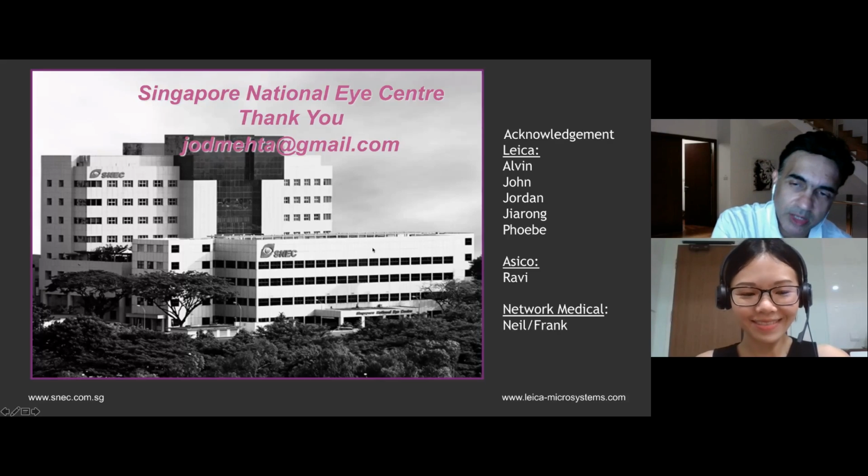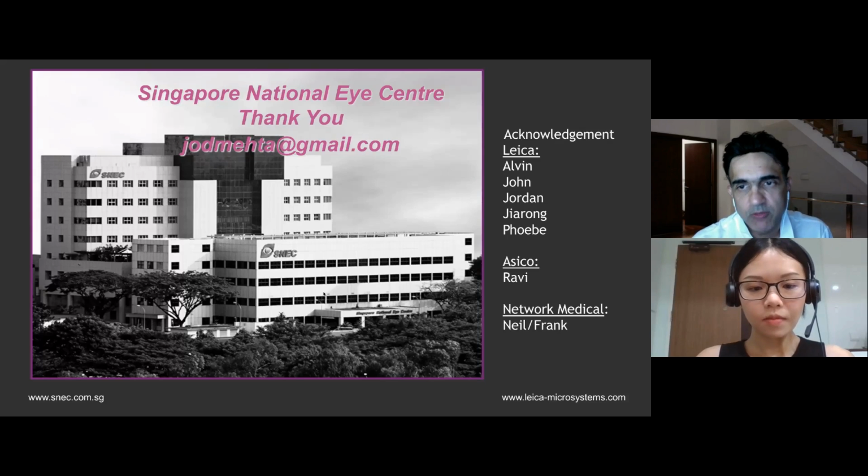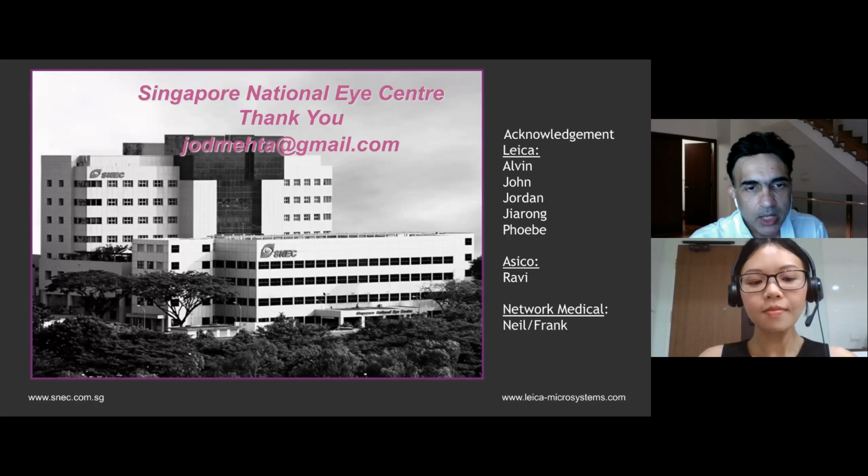I think there are a lot of imaging options that we haven't even shown today, and they give you information on how you can have preset sizes done around the tissue, around the grafts as well, to give you an idea. I showed you some of the advantages of the circular scanning that is available with this, which I think is definitely superior if you're doing lamellar surgery compared to a standard crosshair imaging technique.